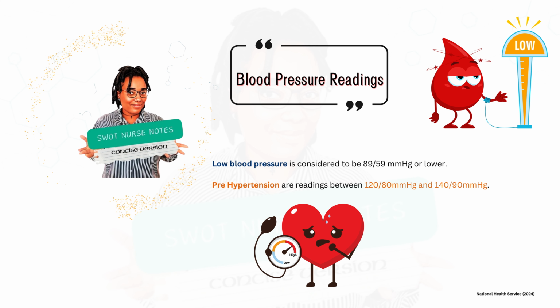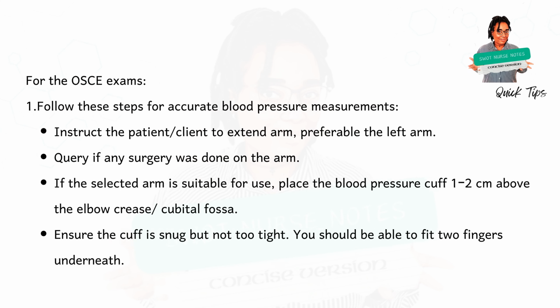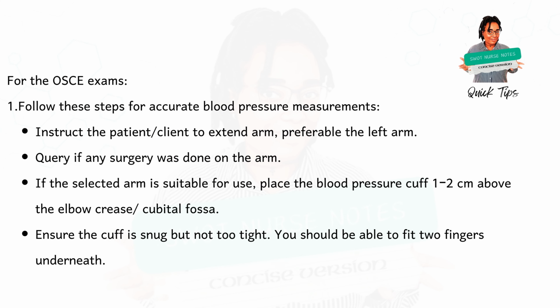For the OSCE exams, follow these steps for accurate blood pressure measurements. Instruct the patient or client to extend the arm, preferably the left arm. Query if any surgery was done on the arm.